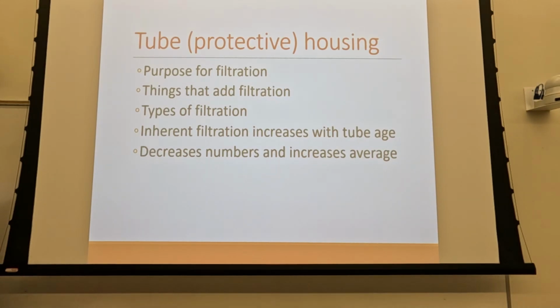You're also not going to go in and shave off parts of the back of your mirror so that you bring that filtration back down. It's increased inherent filtration. Okay. I kind of dissuade you from calling that added inherent filtration because that kind of confuses things. I'd say increased inherent filtration with life of the X-ray tube.